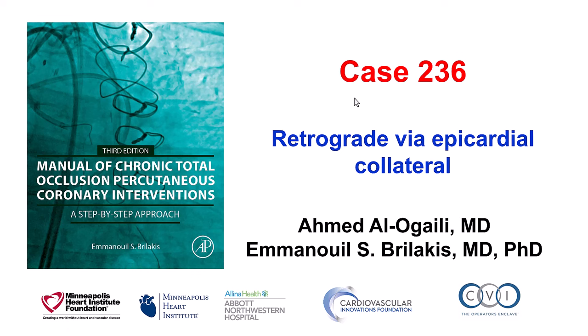This is Ahmed Alogaili and Manos Brilakis, presenting case 236 for the Manual of CTO Interventions. This is a case illustrating the challenges associated with PCI of a right coronary CTO, going retrograde through an epicardial collateral.